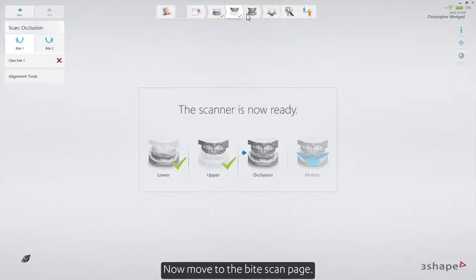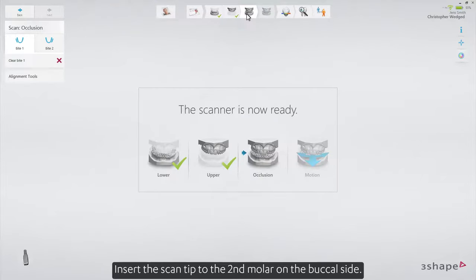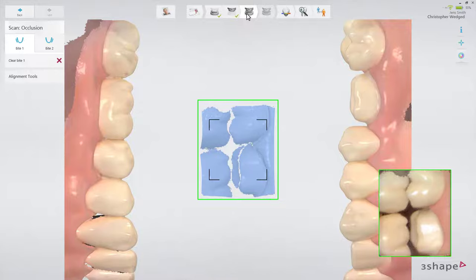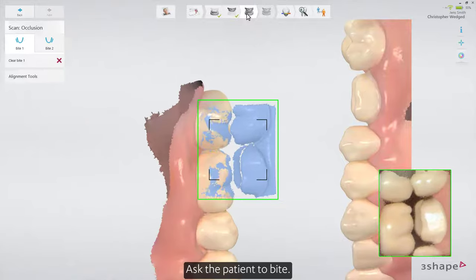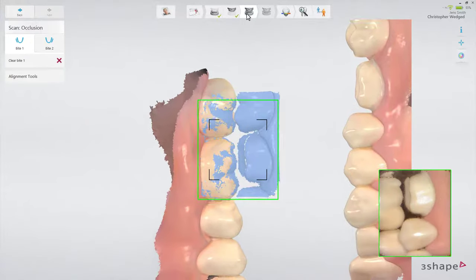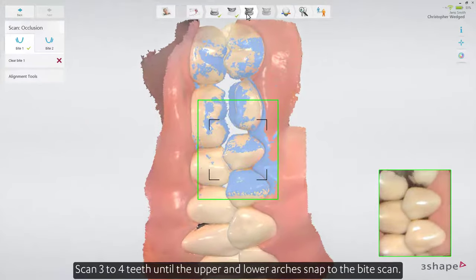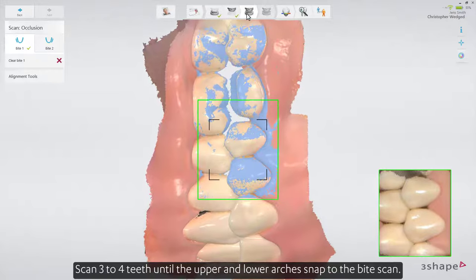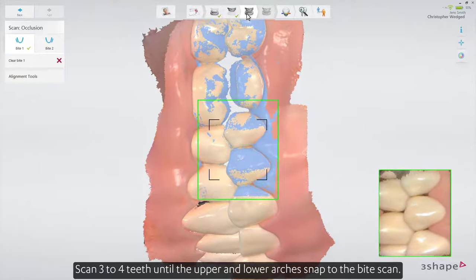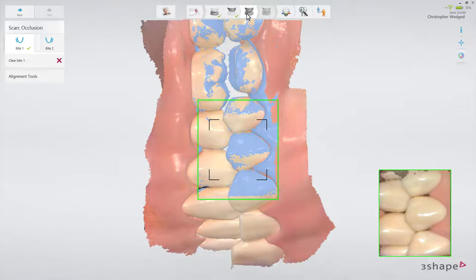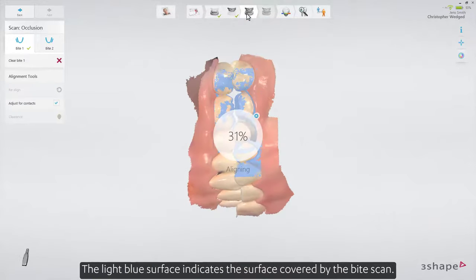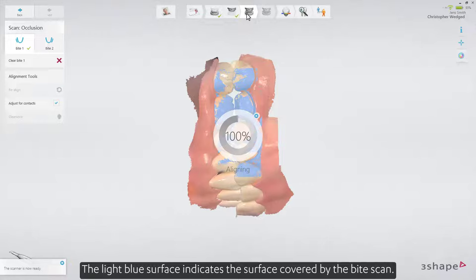Now move to the bite scan page. Insert the scan tip to the second molar on the buccal side and ask the patient to bite. Scan three to four teeth until the upper and lower arches snap to the bite scan. The light blue surface indicates the surface covered by the bite scan.